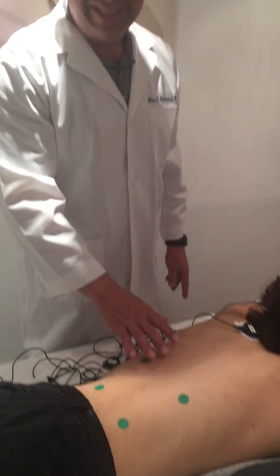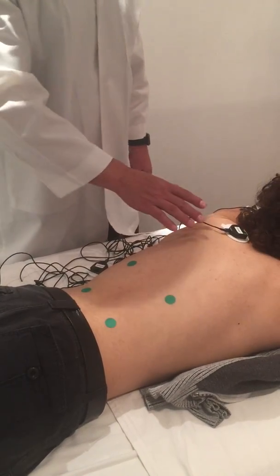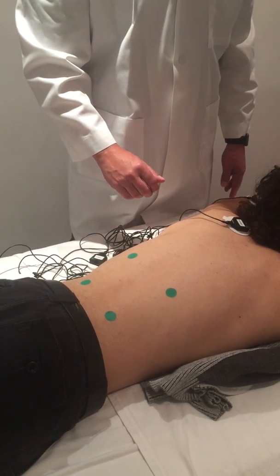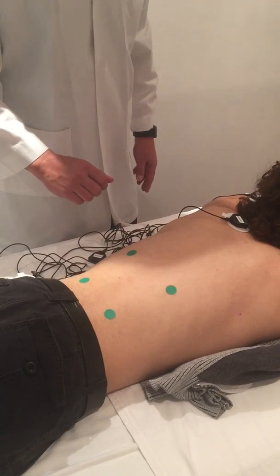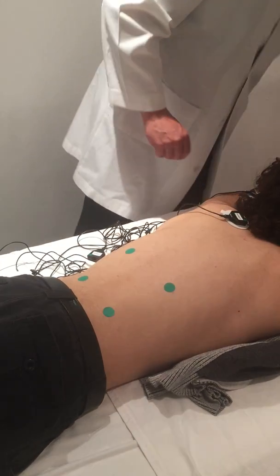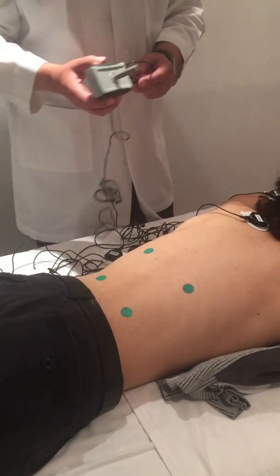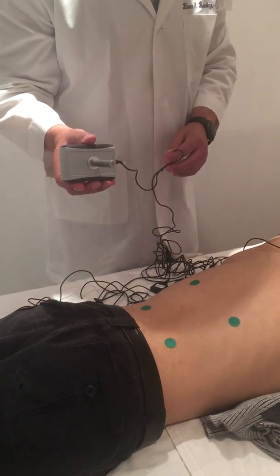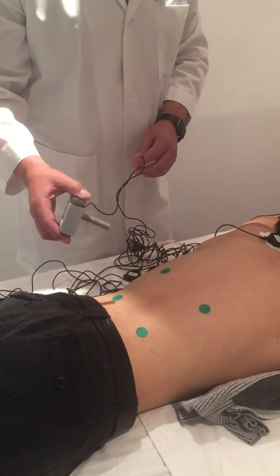Now we're going to go over identifying testing sites. In this case, we've identified a patient who has complaints of low back tenderness. We're going to be testing this patient by use of the algometer. The algometer, which we showed in the introduction to all the testing equipment, is designed to measure pressure at a certain point.